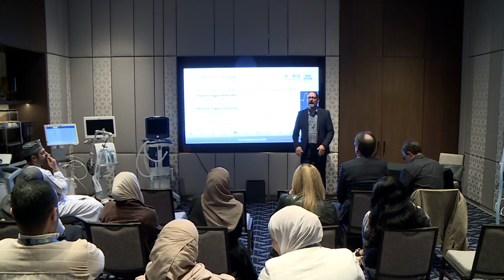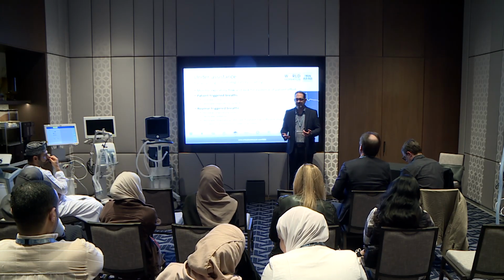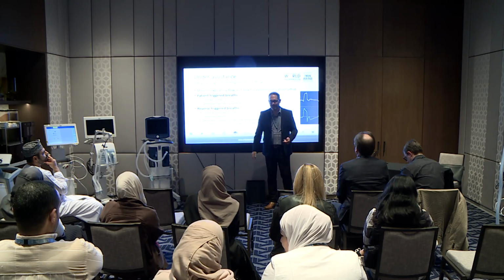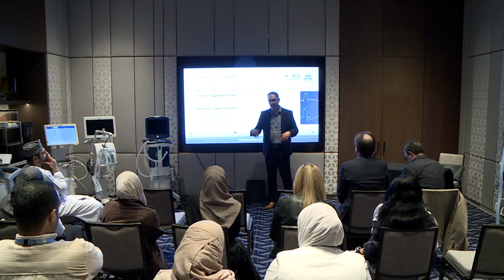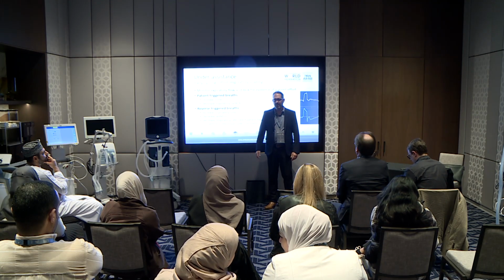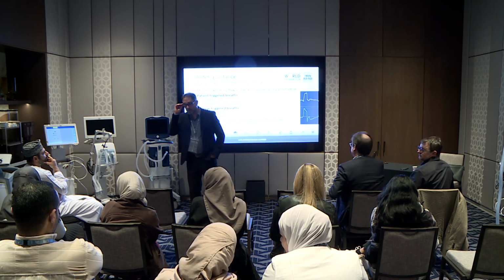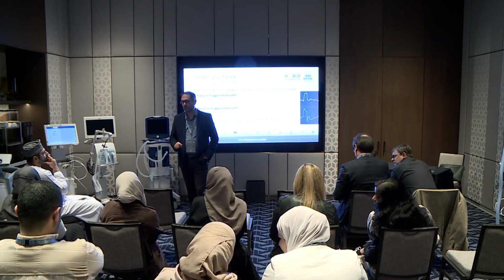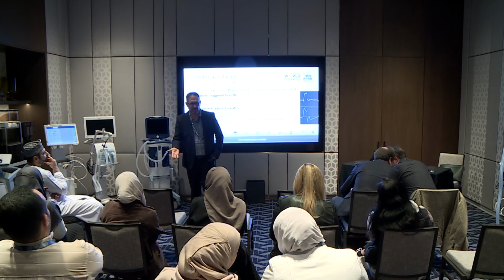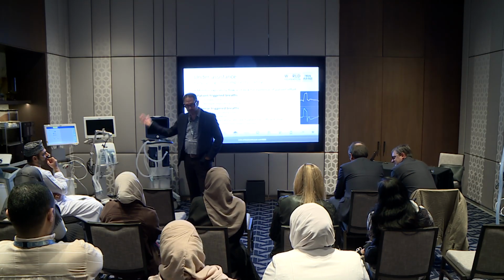Yeah, of course. I'm just saying, some people will say just switch to pressure support to test reverse triggering. If they have true reverse triggering, which is a problem, they might breathe 8 breaths per minute, which eventually you'll have a low minute volume alarm, etc. So I just reduce the rate to 10 usually and wait to see if they start triggering the breath. And with hypercapnia, decreasing the rate? Yes, exactly. So I reduce it to 10, and if they're still breathing 10, or even 11 or 12, let's say they're triggering but it's 12, then the question is, okay, are they still sedated? Let's turn that down.